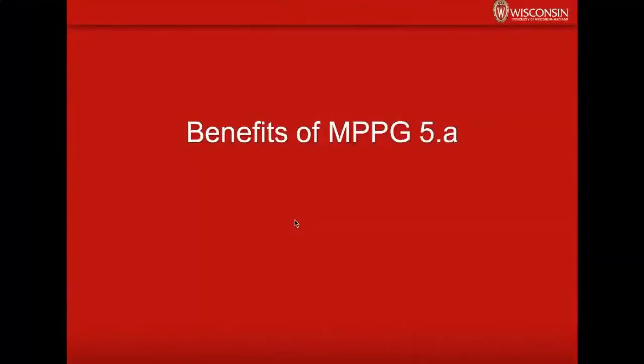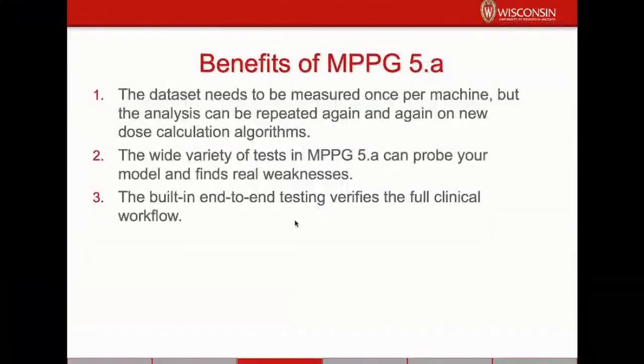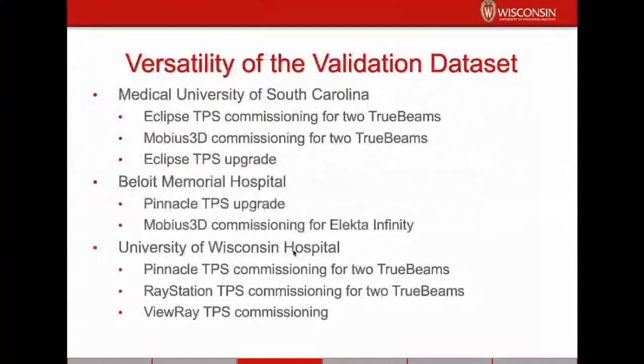So now I will share some of the benefits of Medical Physics Practice Guideline 5A that I noticed during my use of the practice guideline. And I'll go through each of these in turn here. So I'll start by going by way of example and discussing the versatility of the validation data set.